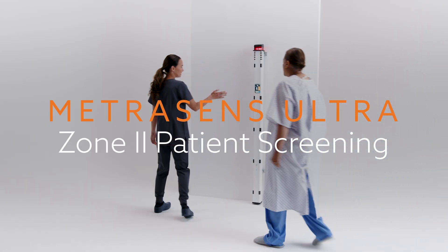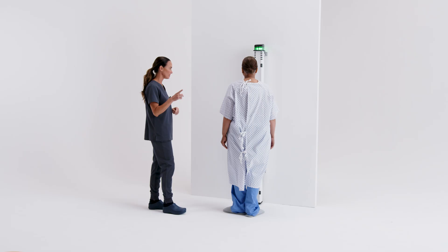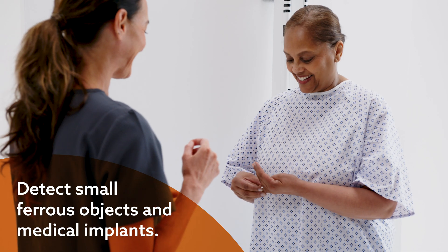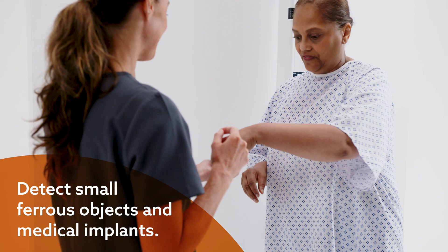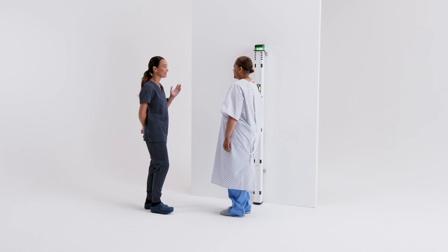Begin in Zone 2 with Metrisense Ultra, meticulously scanning patients for ferrous metals. This advanced detection system identifies even the smallest ferrous objects, including many medical implants, ensuring a clear and safe path to the MRI suite.